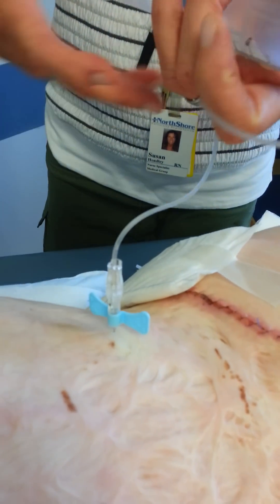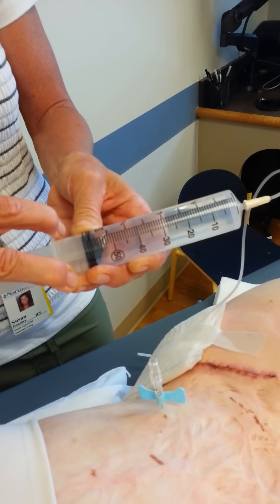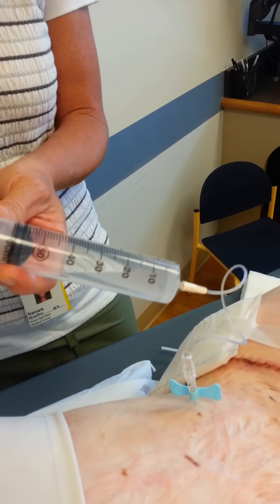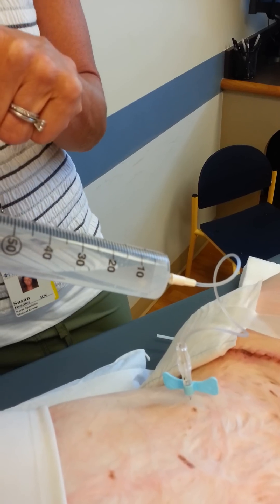And that's it. I could let go of it now. So now I'm going to push in a few cc's of saline. It's going really nicely, easily. And now I'm going to pull that back out. Because if you weren't in the port, you couldn't pull it back out.